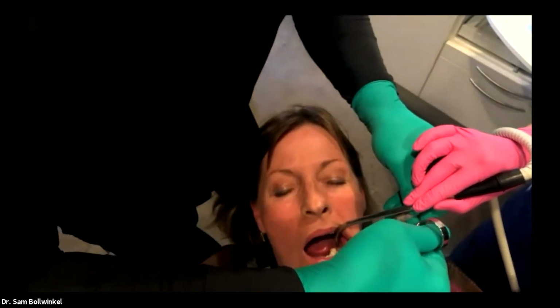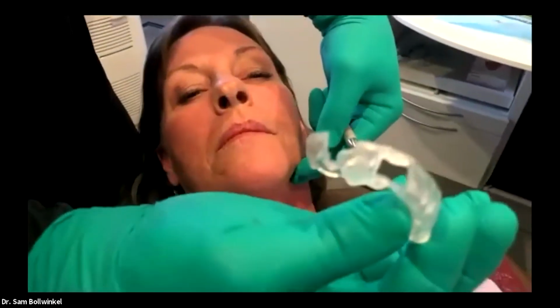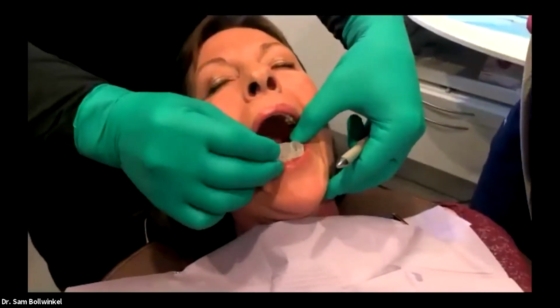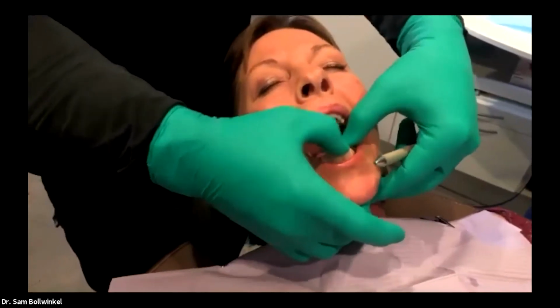Good, I'm just making sure that the soft tissue is numb all the way. We doing all right, sweetie? Yes. Okay. So this is our CEREC guide. We'll take a look at that and see that there. This is one that was milled out for this patient. This is what we walked through on our design earlier tonight. We place that in the mouth and get this great fit. This is an amazing fit, very stable, does not rock.